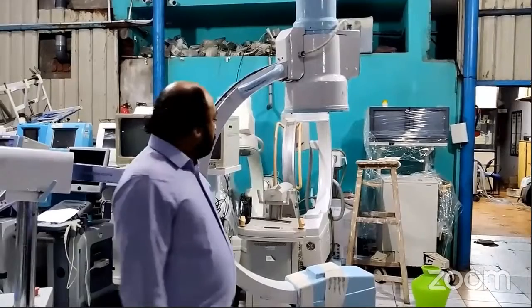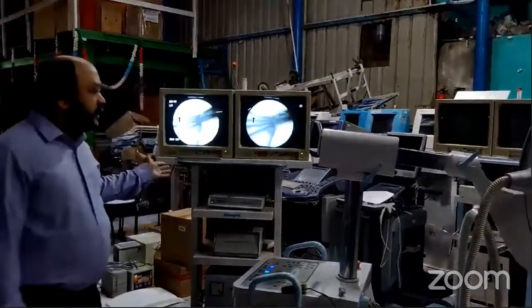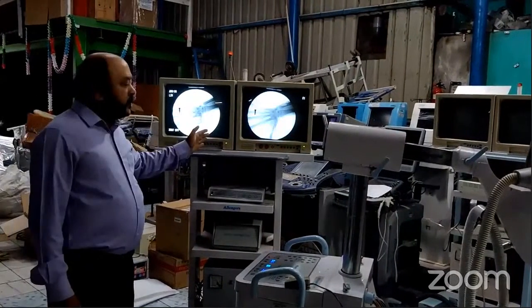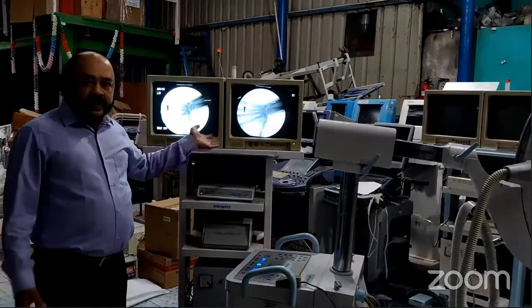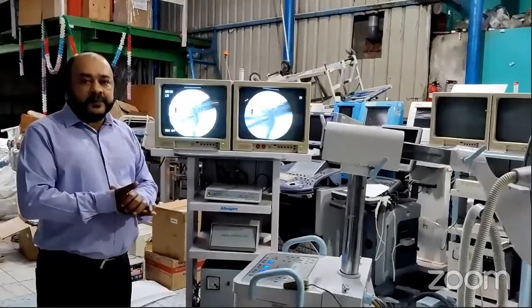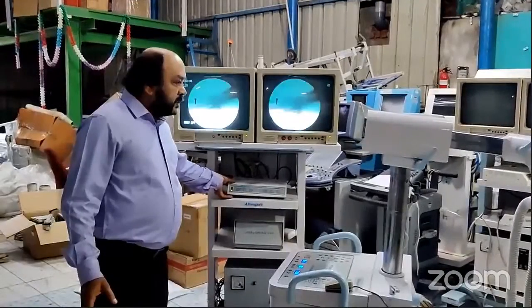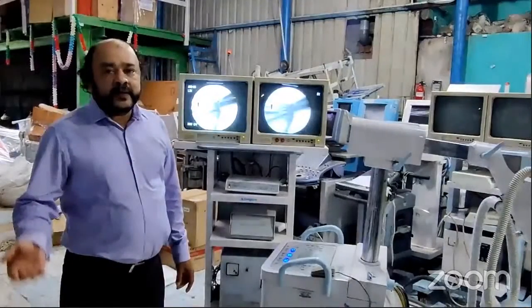Again, in the memory unit there will be two monitors. One monitor shows the live image. On the other monitor you can store the previous one, so that the doctor can see the difference in the object. In this memory unit you can store up to 100 images. Suppose you want to store more images, then you can add a computer and a graphics card, so you can store those also.